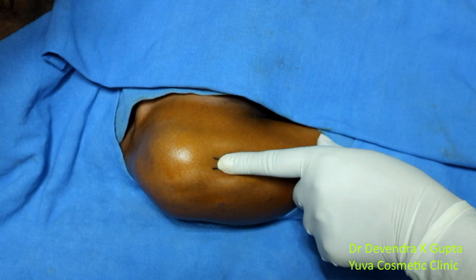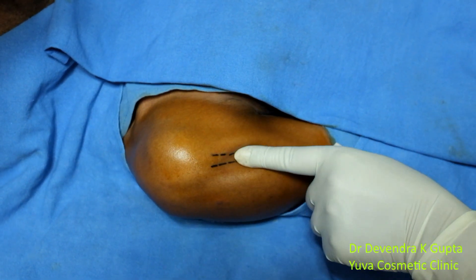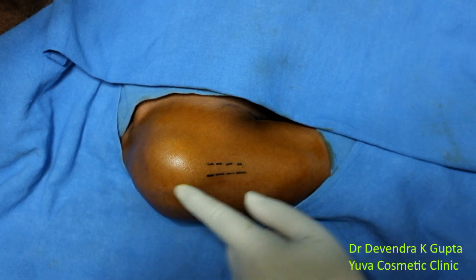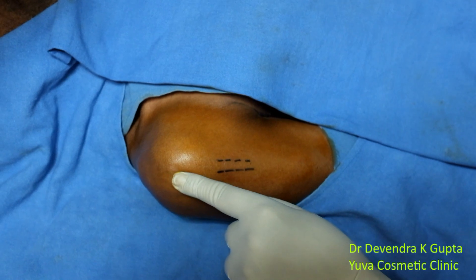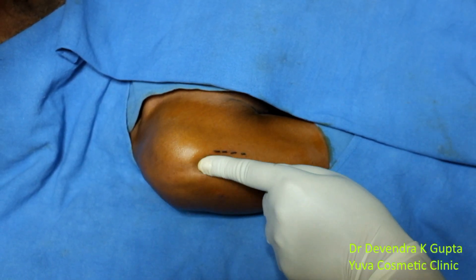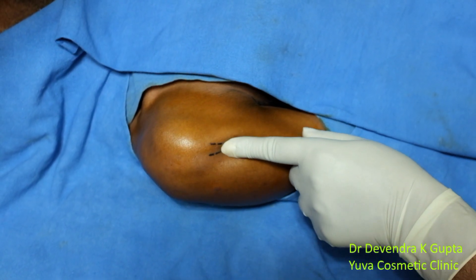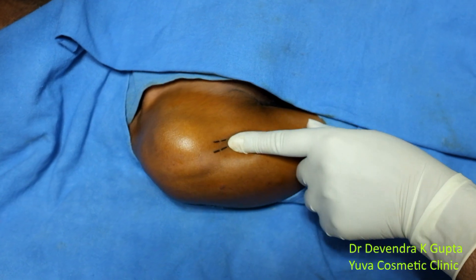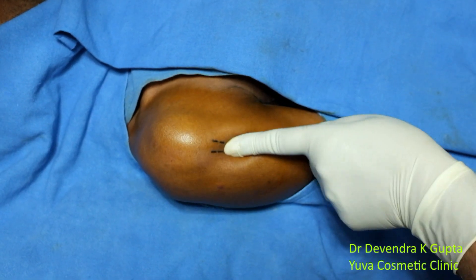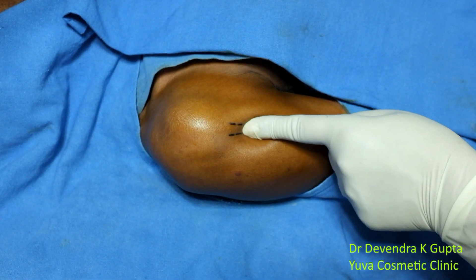This is the bicep tendon and you can see the course along the head of the humerus. We can feel the notch here, and the same is continuous down here. I can palpate this tendon. Now with the help of my index finger, I am displacing this tendon entirely.